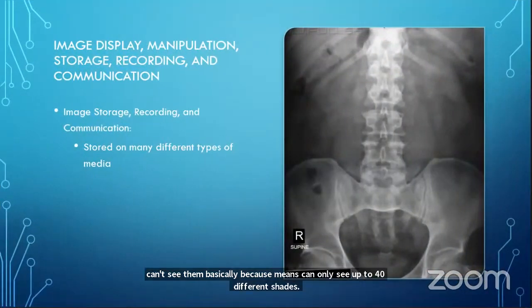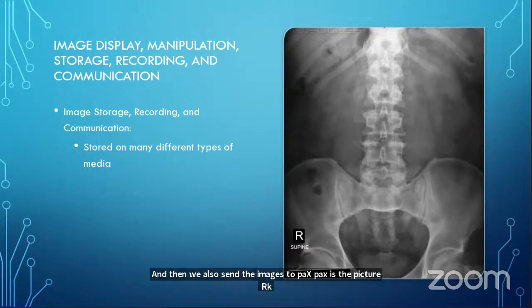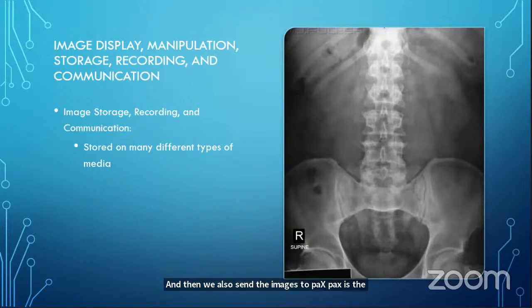So after the images are manipulated and displayed, they're stored, and they're stored in many different types of media. We keep images on our console station in case we need the raw data. And then we also send the images to PACS. PACS is the picture archiving and communication system for imaging, and images are usually stored on PACS indefinitely. And they do that by storing all those images on large servers.